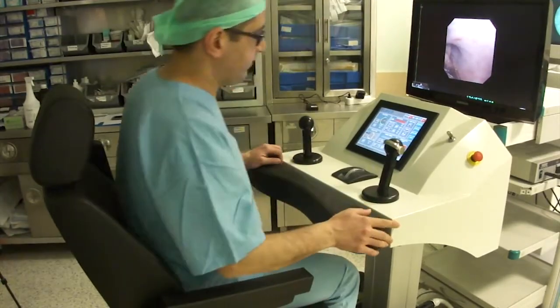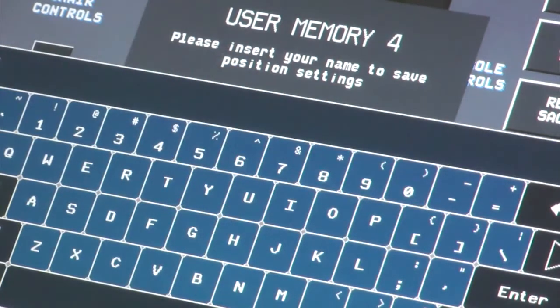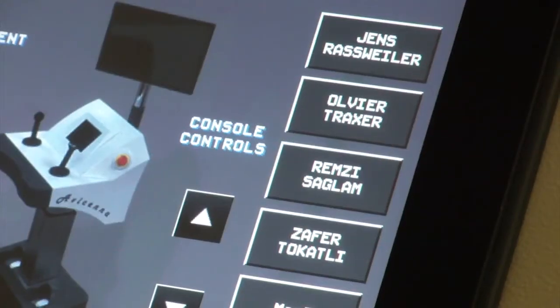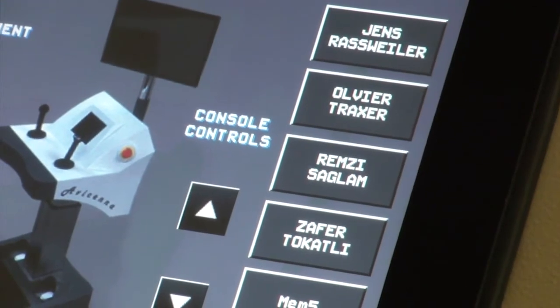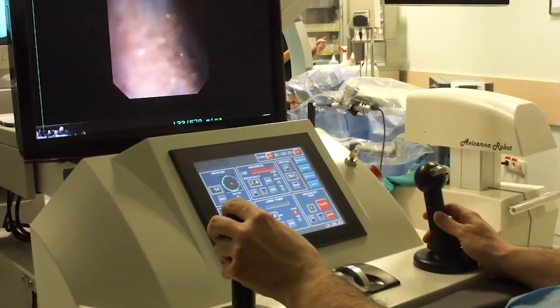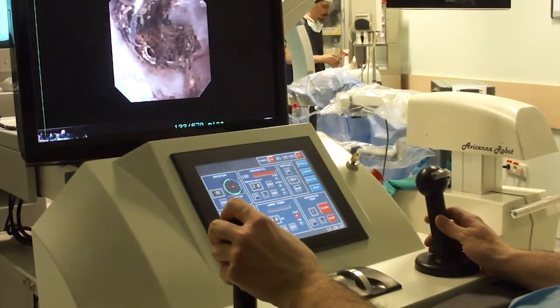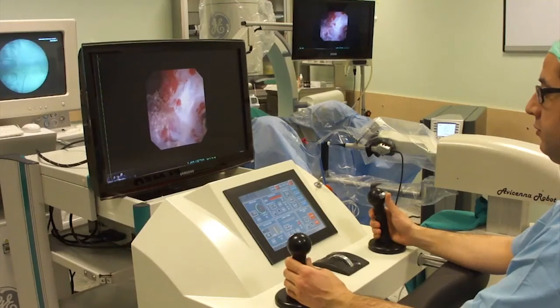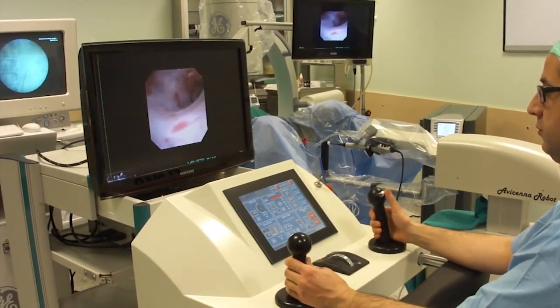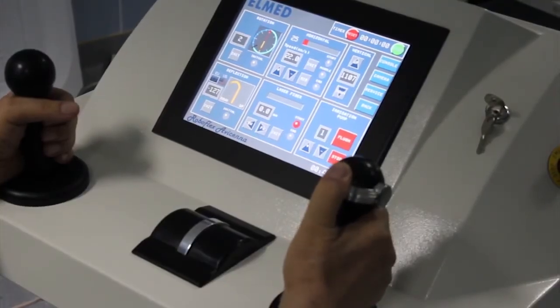The surgeon then sits at the console. The position of the ergonomic chair, armrest, and control panel can be individually adjusted and stored in the system for six users. To manipulate the endoscope, the surgeon controls two joysticks.